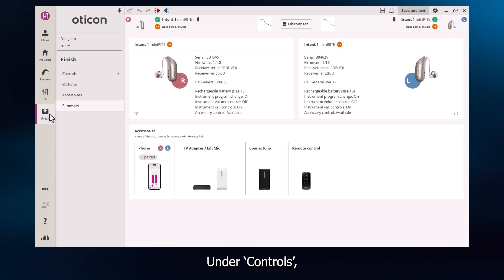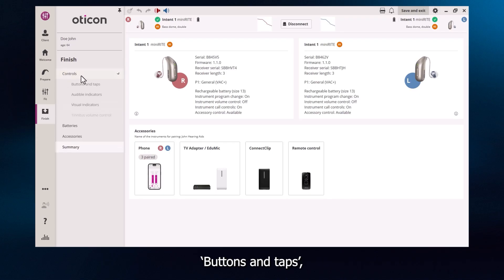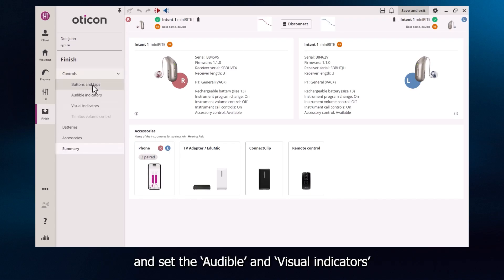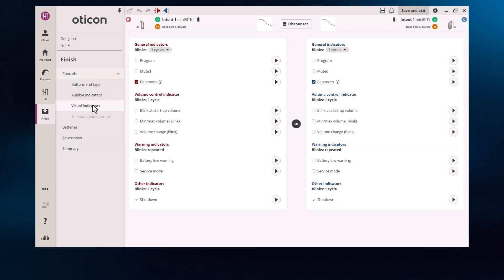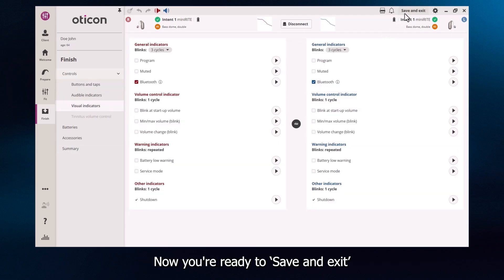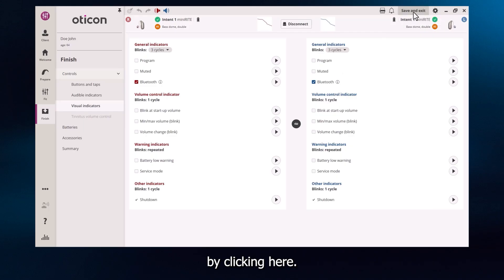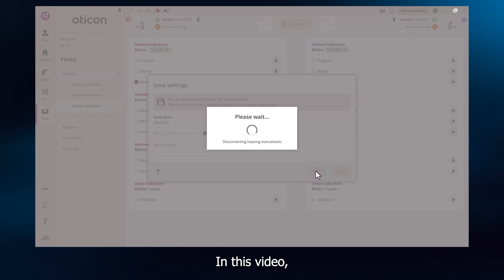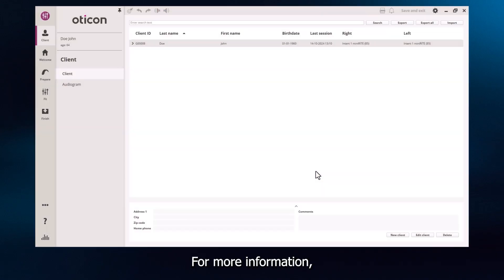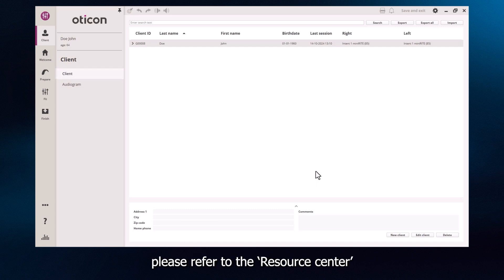Under Controls, customise the functionality of buttons and taps, and set the audible and visual indicators to suit your client. Now you're ready to save and exit. Your client's hearing aids are set up and ready to go. In this video, we walked through a first fitting in Oticon Genie 2. For more information, please refer to the Resource Centre or visit the Oticon website.